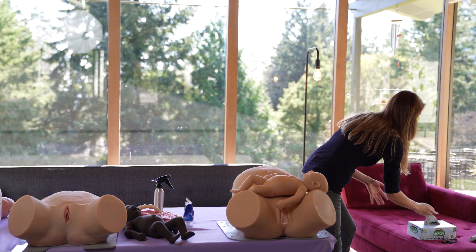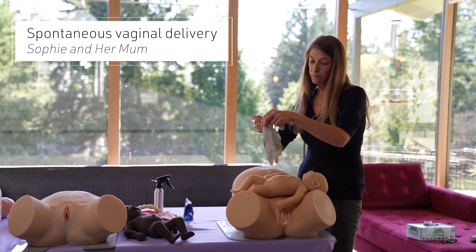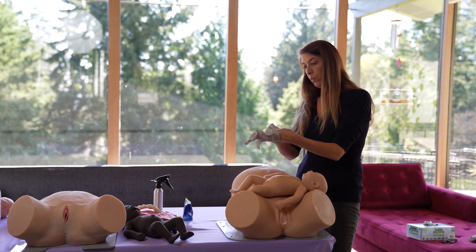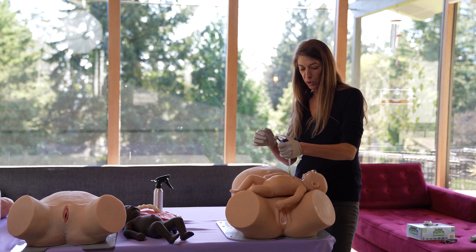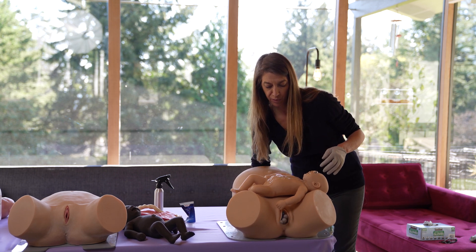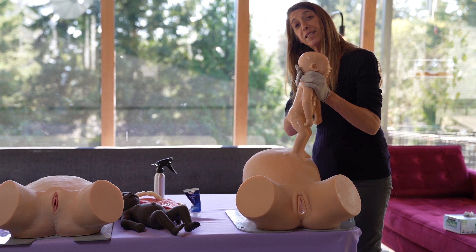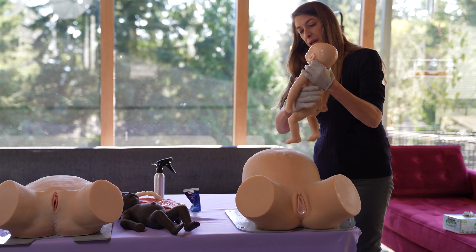We'll start with a basic spontaneous delivery and then move on to breech and shoulder dystocia. It's best to wear gloves because you're going to get very lubed up. You start with an ample squirt of lube, and after the first application you won't need as much. As you're getting her set up, you lubricate the inside of the mom and rub the lube all over Sophie.